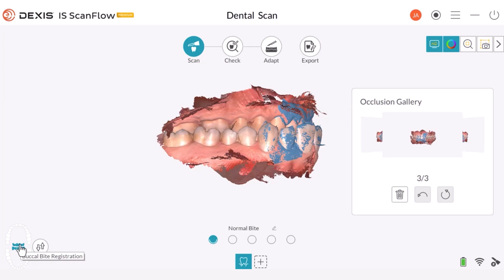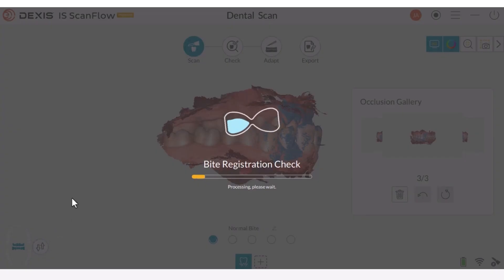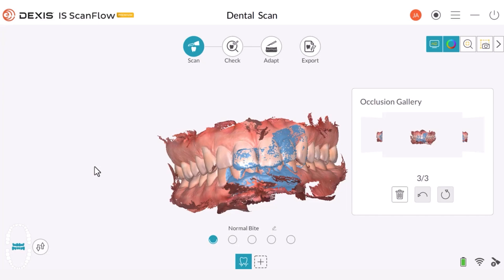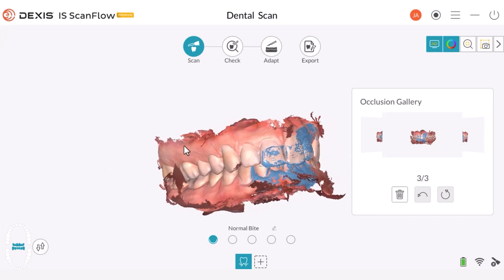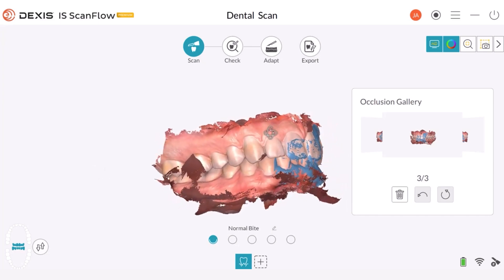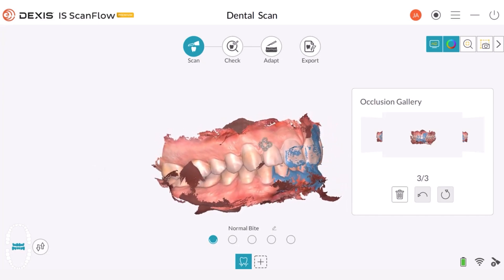Once I choose the switch button, the arch is now properly labeled with just one click. My mandible and maxilla are now correctly oriented — they are simply reversed from what I had before.